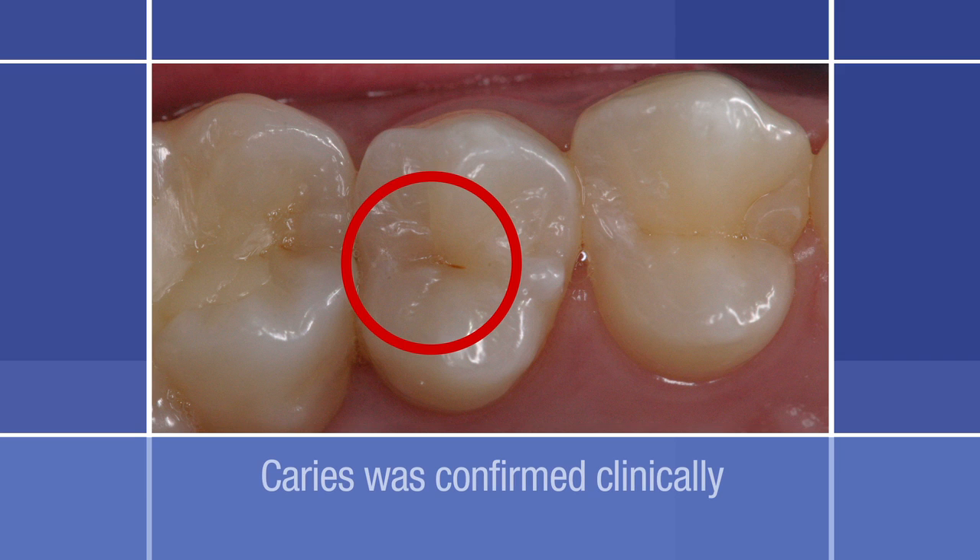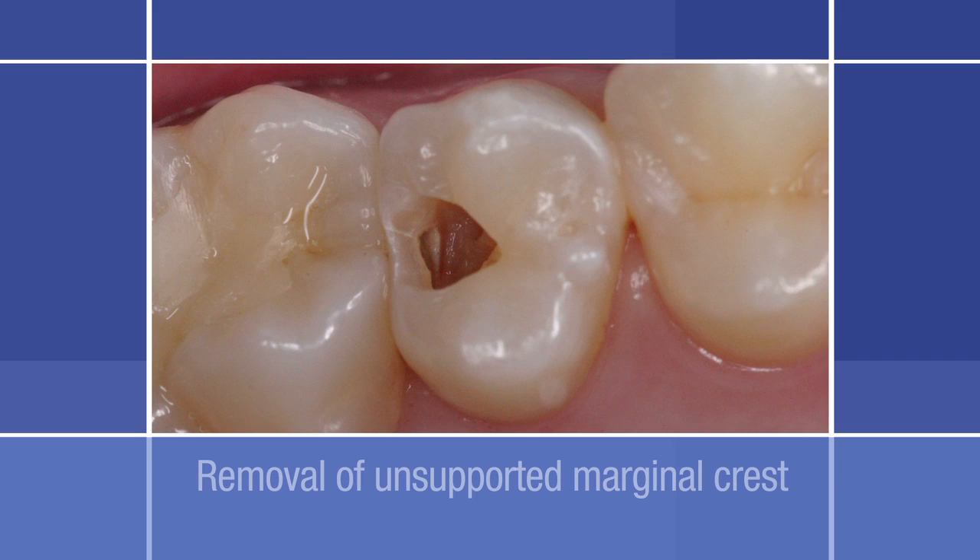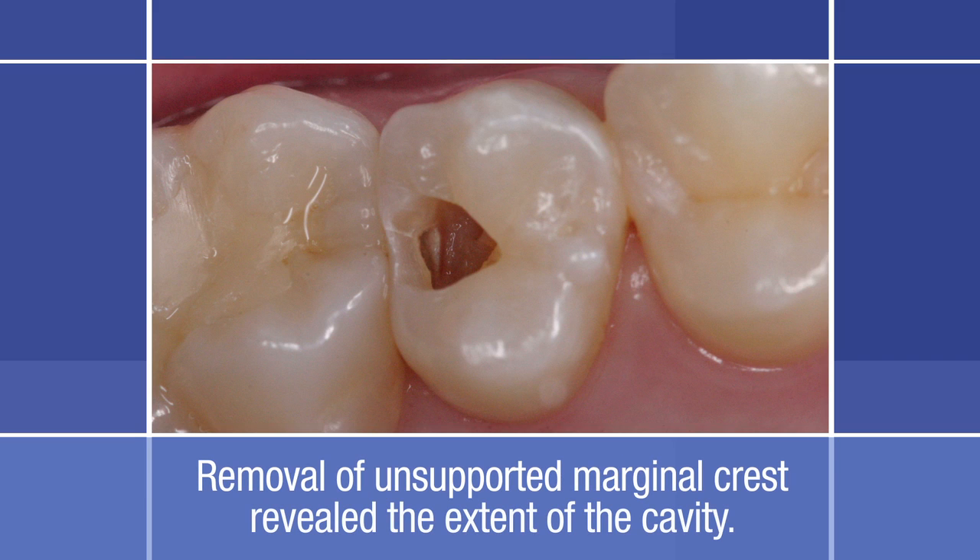The caries revealed during X-ray examination was able to be confirmed clinically by some loss of enamel translucency. The extent of the decay revealed by the X-ray film justified splitting off the unsupported marginal crest. After removal of the unsupported marginal crest, the extent of the cavity was revealed. The origin of the decay was the dissolved enamel at the contact point.